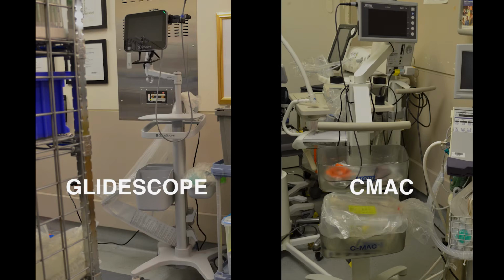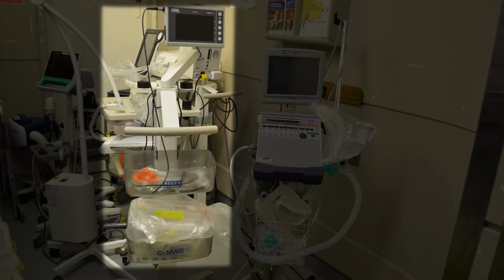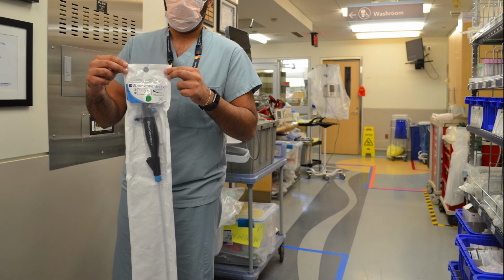The glide scope is located in the hallway outside resus and has an attached airway bag with all the intubation equipment you'll need. The CMAC is in the supply area by the RT cart and also has an attached airway bag with similar equipment. The only real important difference between the glide scope and the CMAC in our department is that the glide scope uses hyperangulated blades while the CMAC uses regular geometry Macintosh blades. The glide scope has a disposable bronch attachment hanging on the stand as well. Choose whichever device you feel most comfortable with.